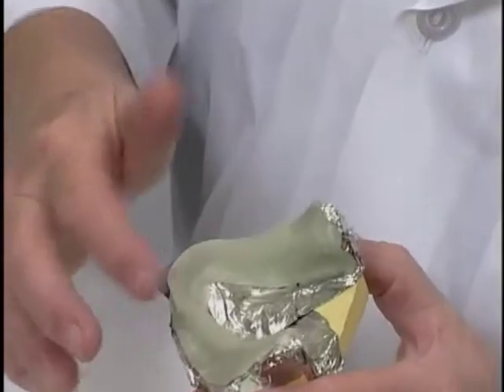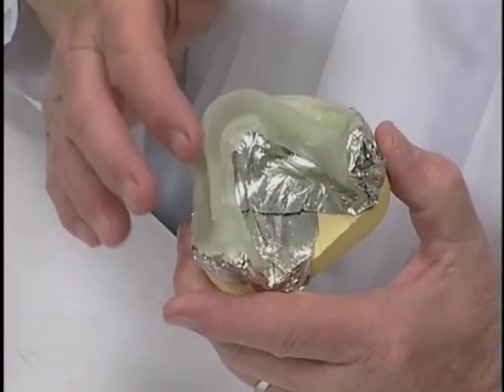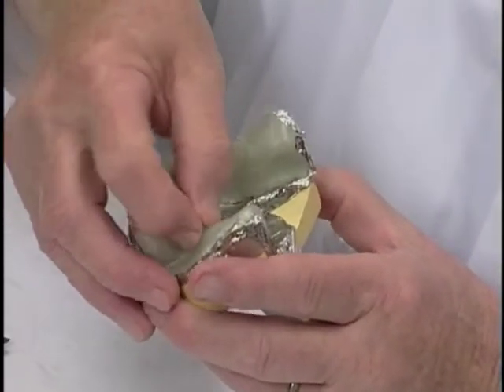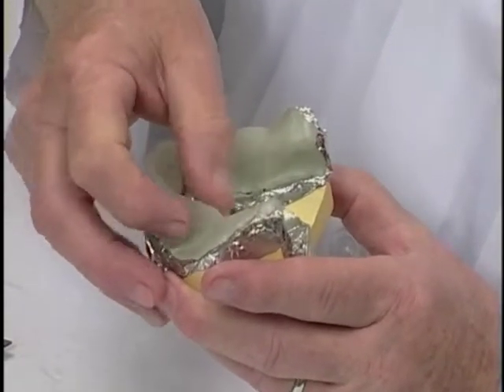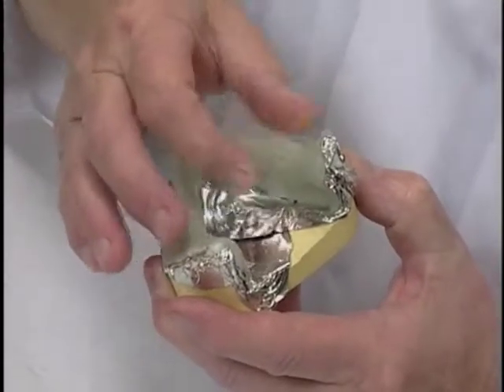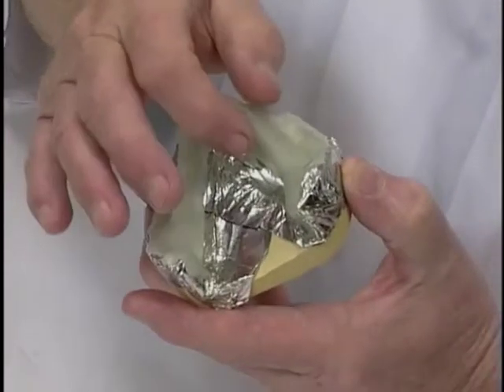And I like to have that posterior part of this handle that's built up back there come to a knife edge at the top of it. The reason for that we will discuss a little bit as we're making final impressions. This really basically, by building it up to a knife edge posteriorly, allows us to gauge how much pressure we're applying as we make a final impression.